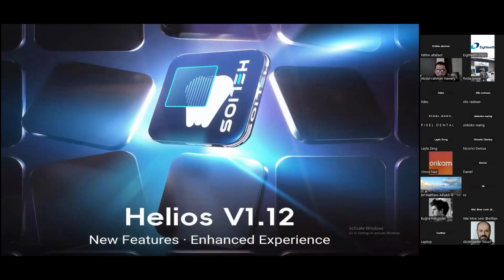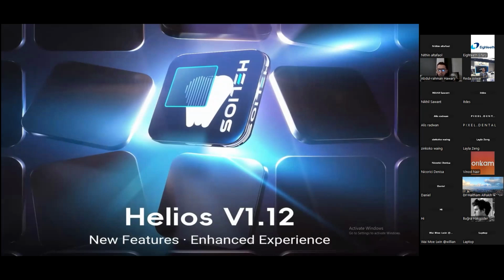Like we like to say in our caption, we have new features and enhanced user experience. Whether you are the dealer and you will have to pass on this experience to your clients, or whether you are already a user, you will have an enhanced experience in general.